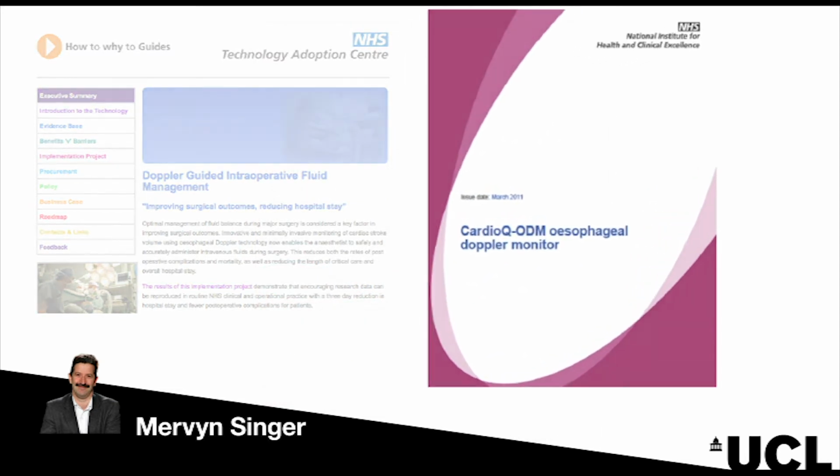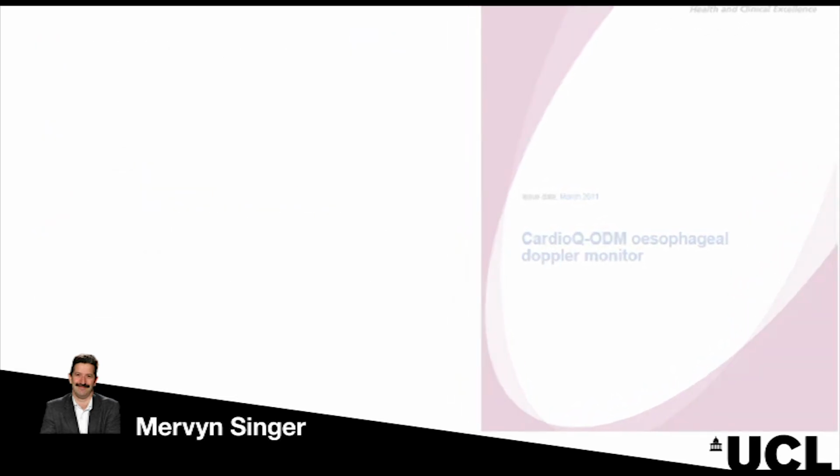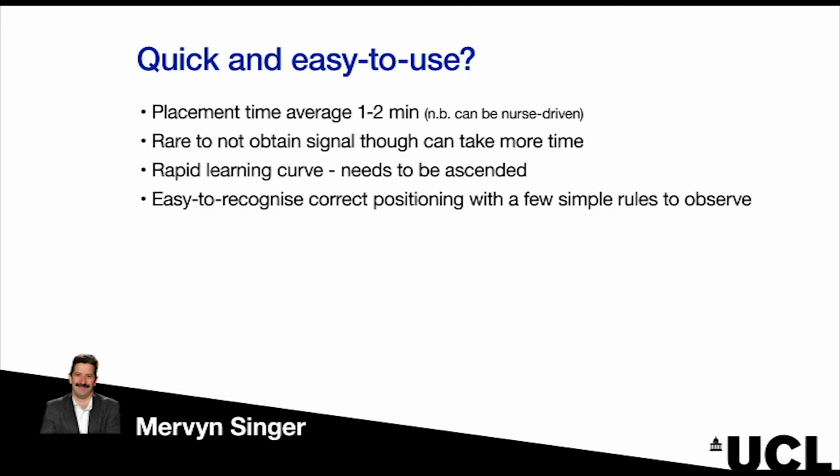As part of this, there was a study done in a few hospitals, 3 hospitals in the UK, that was published in the British Medical Journal, where they did a before-after study. So they looked at outcomes after major surgery, and then all of the anaesthetists in the departments of these 3 hospitals were taught how to use the Doppler probe, and then they used it, and they found that there was a significant improvement in the length of stay of these patients who had had their intraoperative fluid management carefully titrated using the Deltex cardiac output machine.